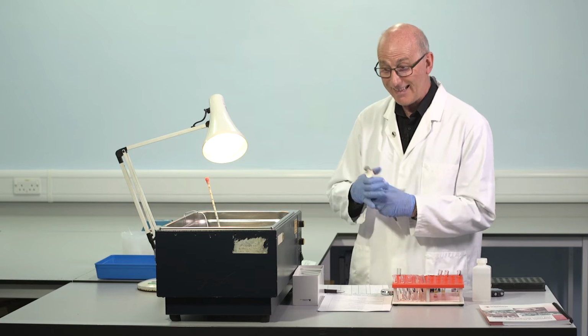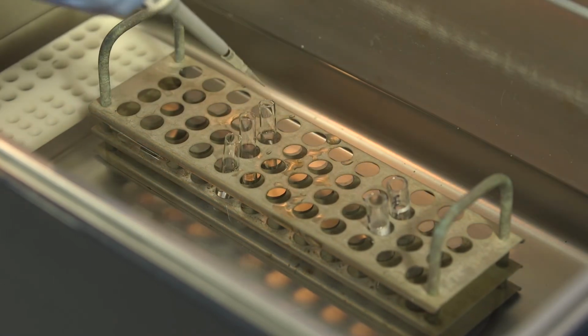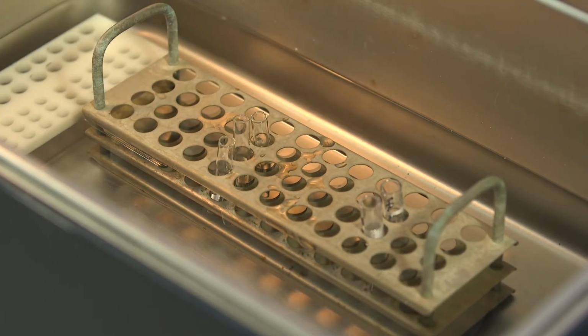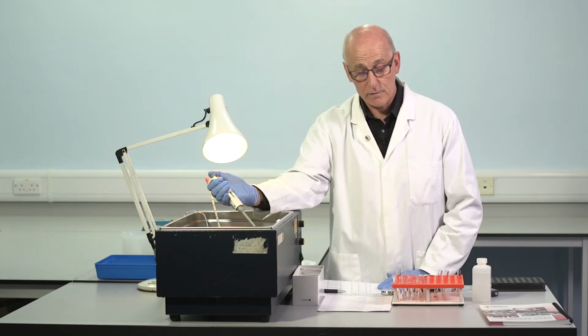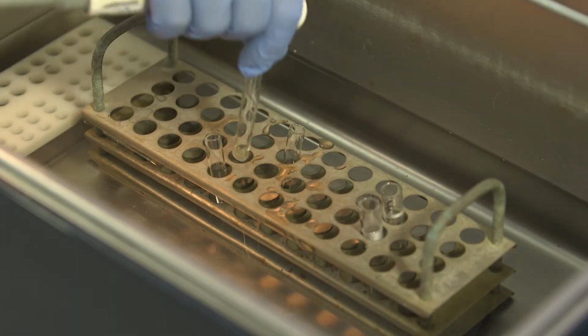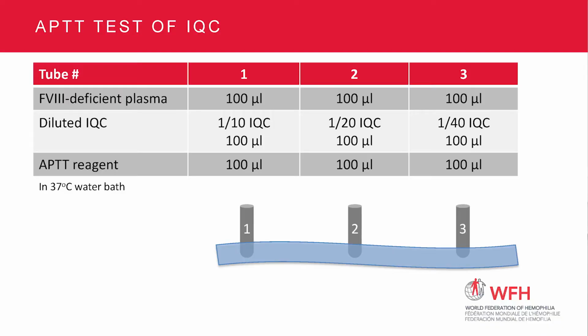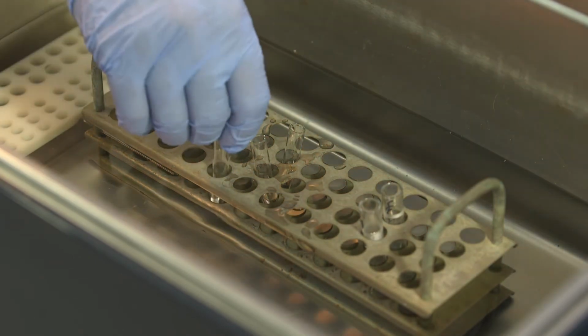So we will now add APTT reagent to the first tube, 100 microlitres, and mix. Start the stopwatch. 3-minute activation. Second tube, different dilution, different concentration, 15 seconds, and mix. Third tube, APTT reagent, 30 seconds, and mix.